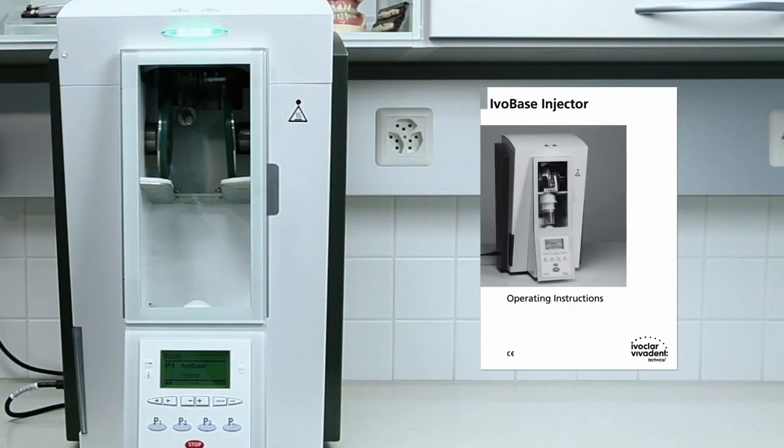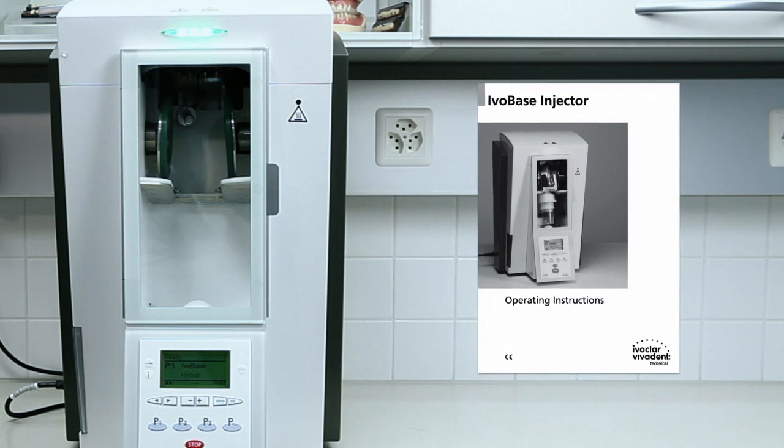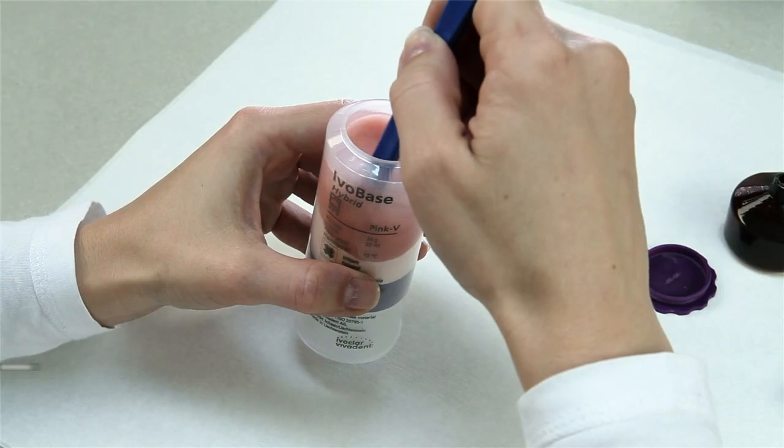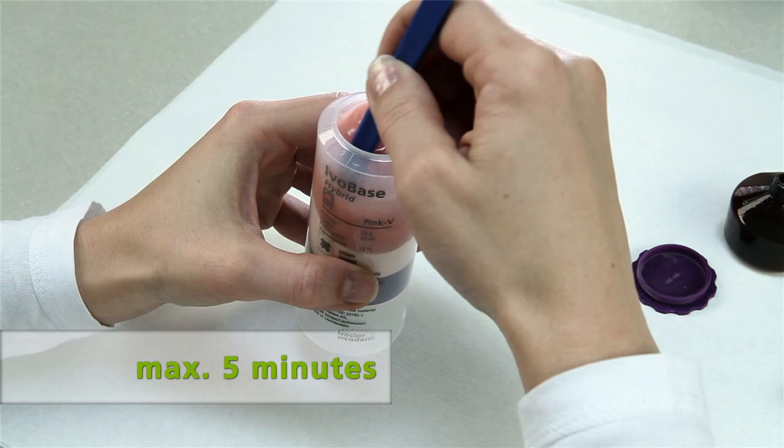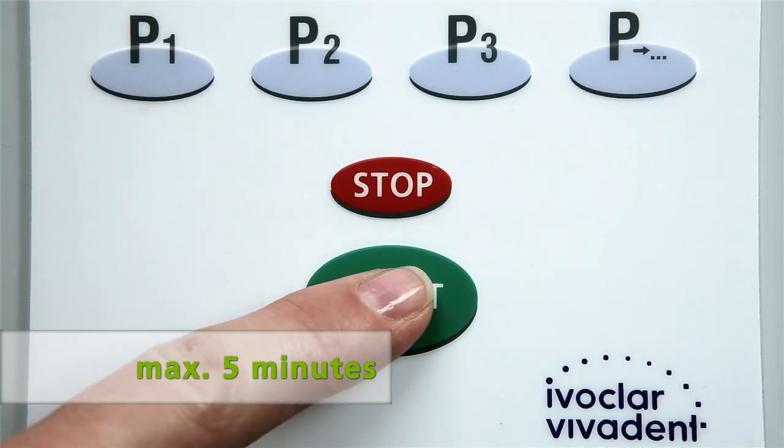The operation of the IvoBase injector is described in detail in the corresponding operating instructions. No more than 5 minutes should pass between mixing the material and the start of the polymerization program.